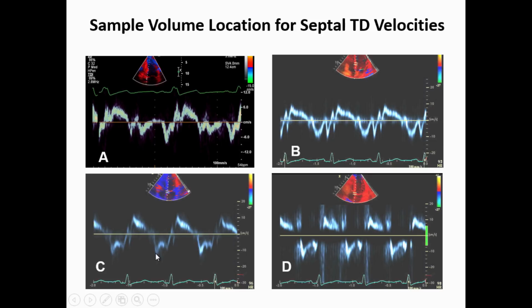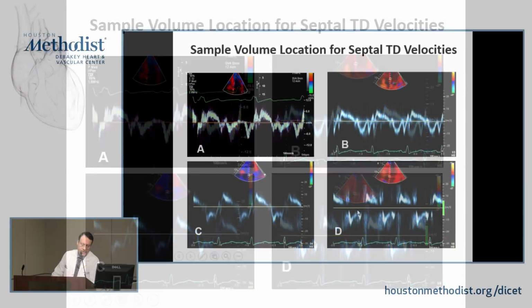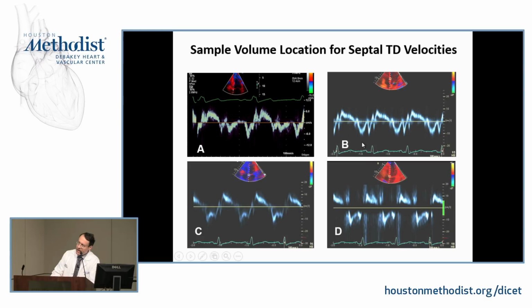If you look here, what is wrong here? The gains were turned down too low. Here the filters were cranked up too high. So these are not satisfactory signals. Sometimes we are in a hurry, both acquiring signals and also trying to go fast through a study, and you end up not paying closer attention.